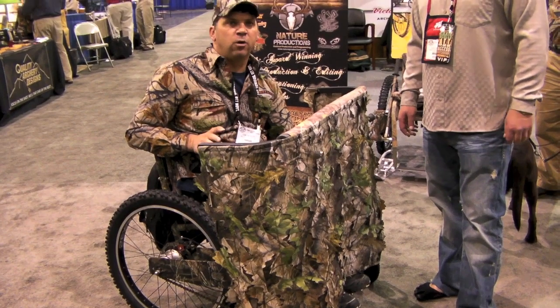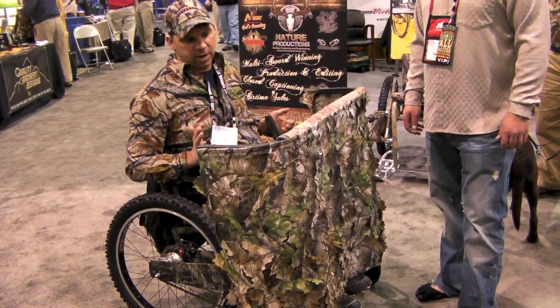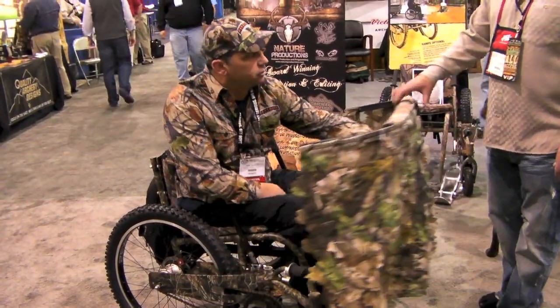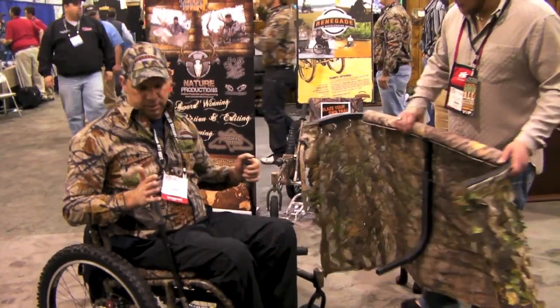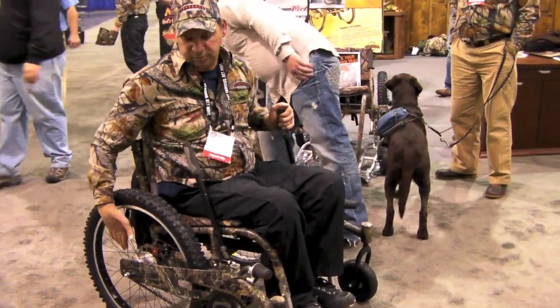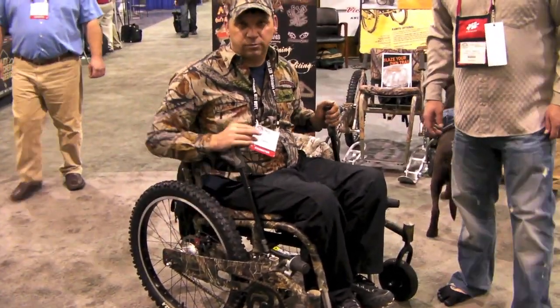Every time it snowed, I couldn't go out in the woods because I was pushing hand to wheel. But now with this chair, it runs with levers. This is a removable blind — you can just move that easily. And these levers and all the chair, it's a nine-speed gear system. It's mountain bike technology that works for the chair.